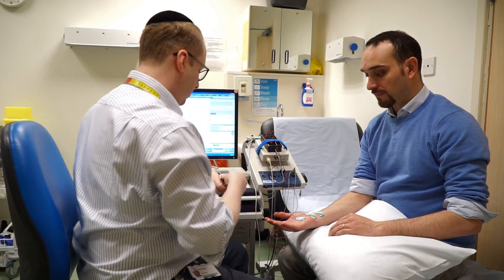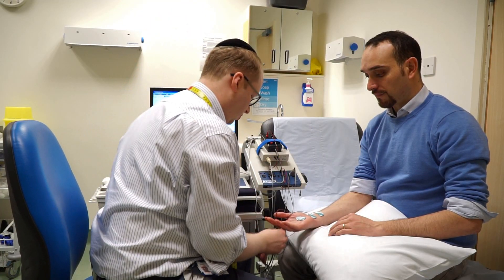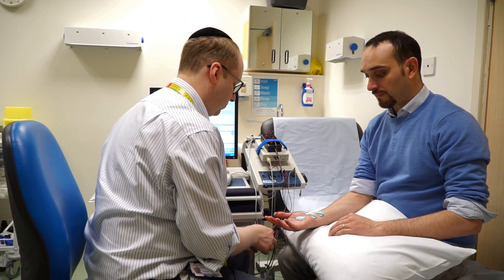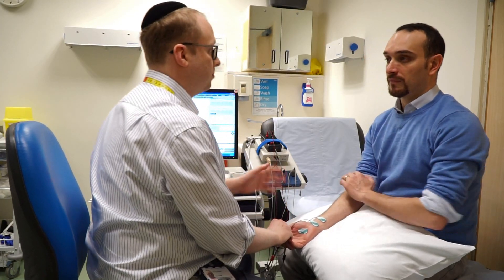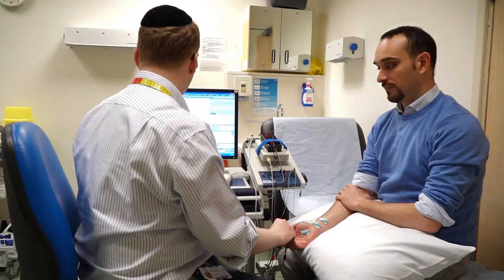What I'm going to be doing is send a couple of signals across the nerve using small taps of electricity. Hopefully it shouldn't be too uncomfortable — if there's any problems, just let me know at any point. And here we go.